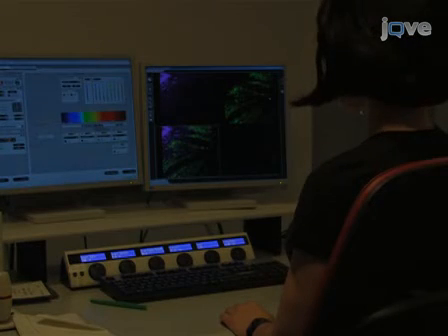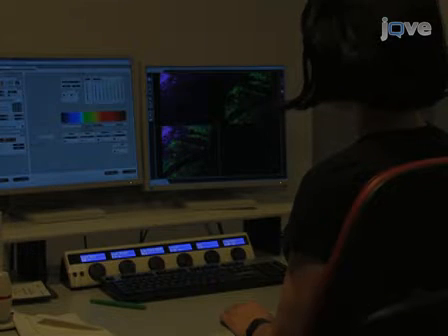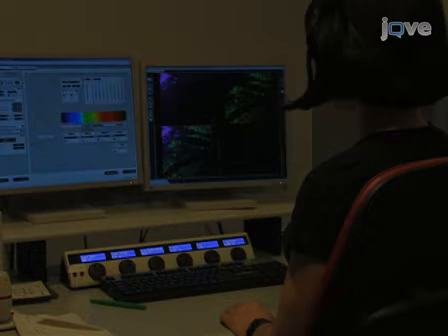Begin by observing the tumour through the eyepiece with a green fluorescent filter. Locate major blood vessels that are visibly flowing and laying flat in the same focal plane. Position one of the vessels in the centre of the field and switch to PMT detection. We will set up sequential imaging collection for 2 channels.